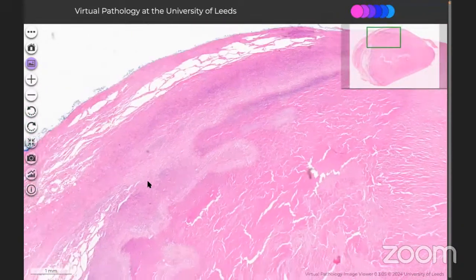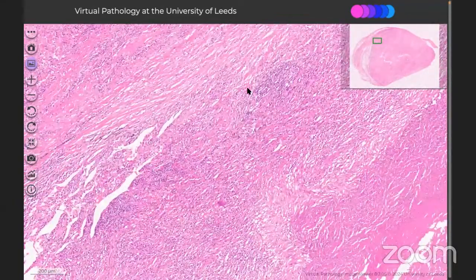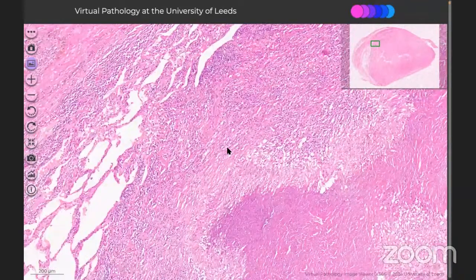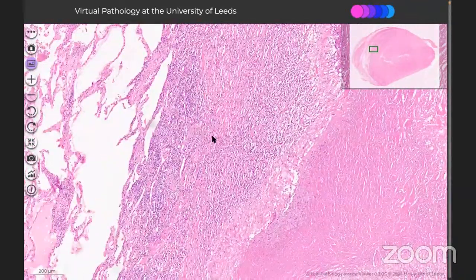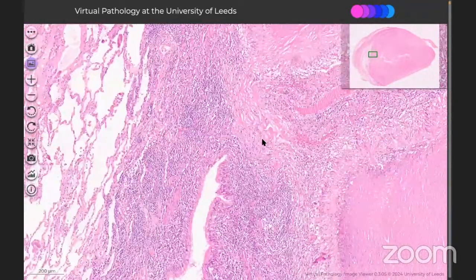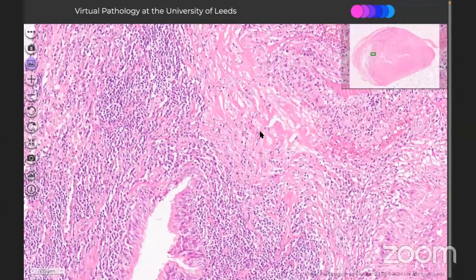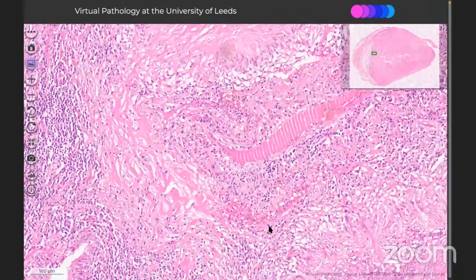But the thing is that when you see this vasculitis, there should be some concern about rheumatoid arthritis also. So definitely you should do some serological evaluation, because these are again a fibrin-rich granuloma, fibrin-rich area, and there is a vasculitis. So you should suggest that rheumatoid nodule is another possibility. So how will you approach this case?